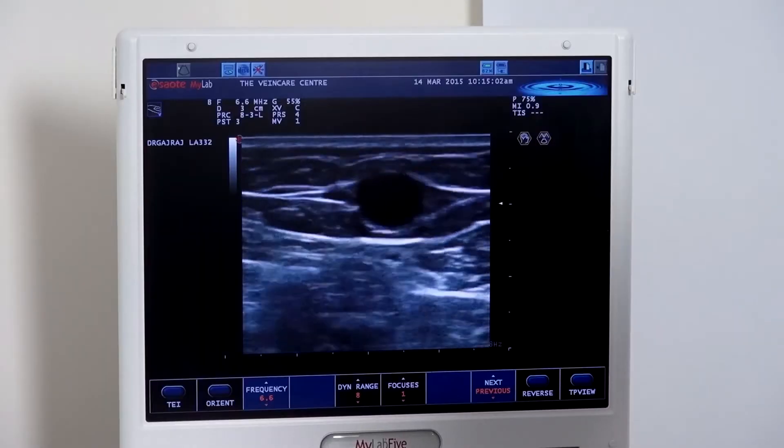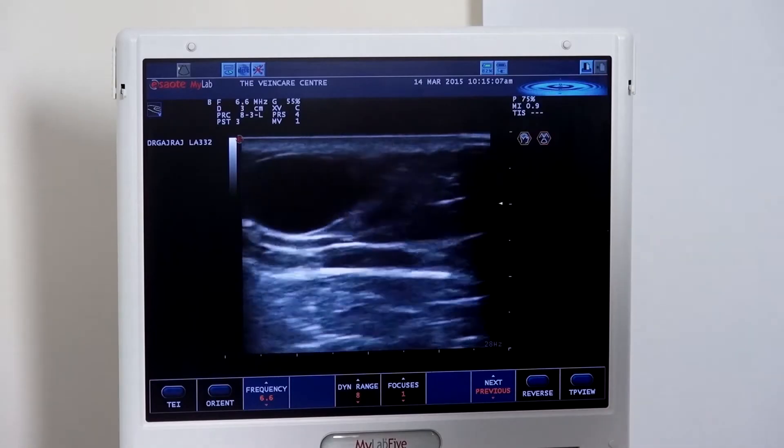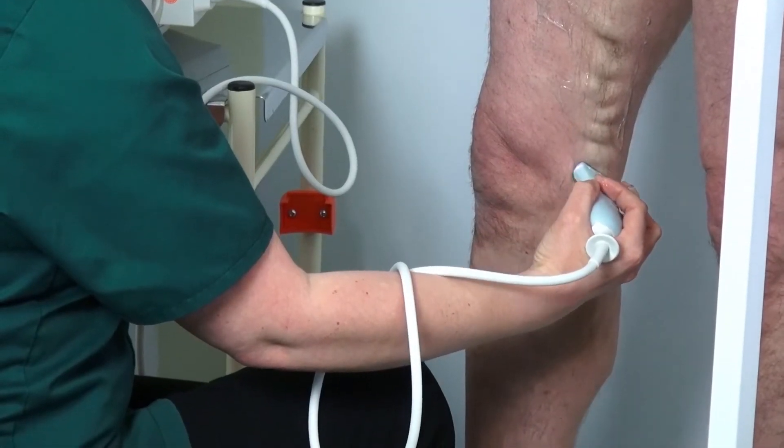Now we're going to move on to have a look at the short saphenous vein, and also to check the popliteal vein for deep vein incompetence distally.